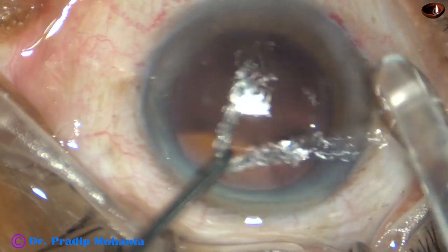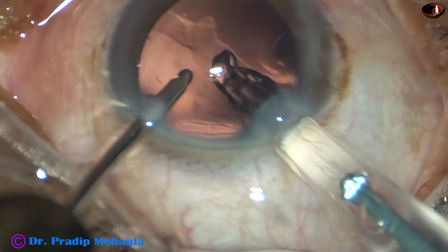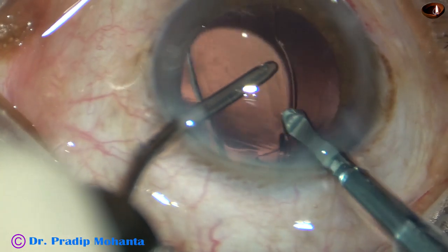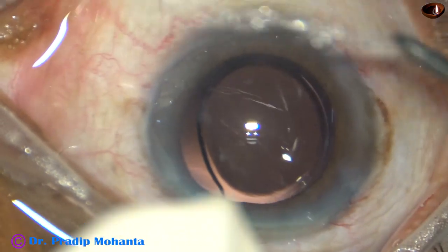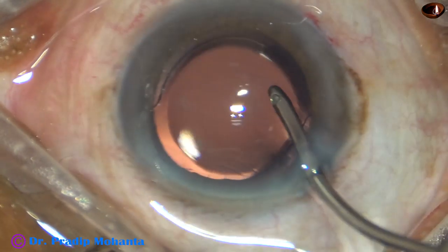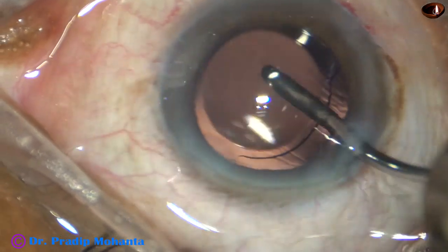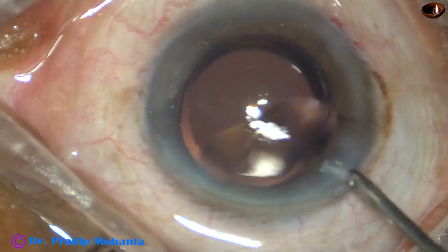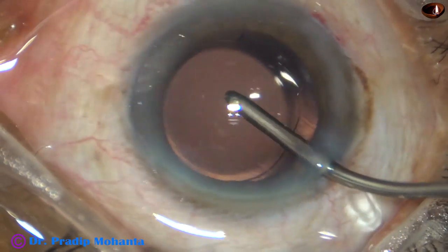An intraocular lens is being implanted in the capsular bag. This is hydro implantation — the anterior chamber is kept formed by irrigation and the lens is implanted. The lens is dialed by the irrigating probe itself, followed by irrigation of the capsular bag behind the IOL. There is no viscoelastic used, saving a lot of time.